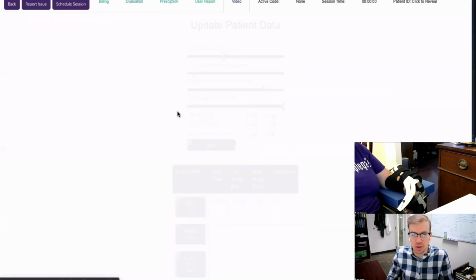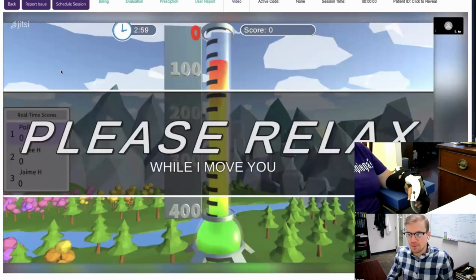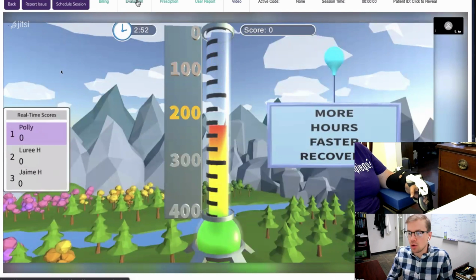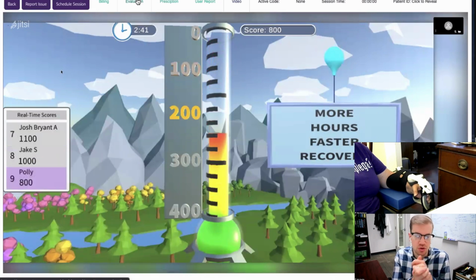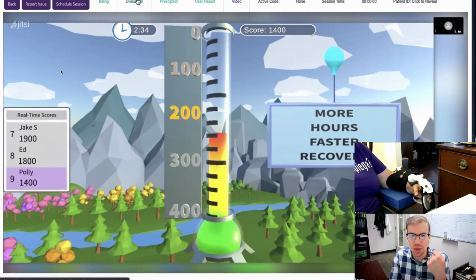Well, okay, so let's go ahead and hit play here and let's see what's going on. Very good. So this one, as you probably can tell, is more of a tone reduction game. Now, we very much encourage people to try their best to extend, right? Because one of the best ways to get the reduction in tone of our flexors is actually to use the thing called reciprocal inhibition. So whenever your extensors turn on, that reflexively will turn off your flexors. So we can leverage this circuitry that's built into our spinal cords to help with this process.